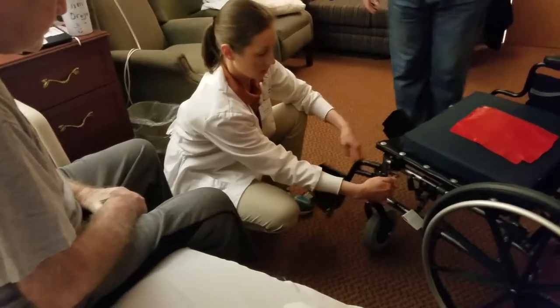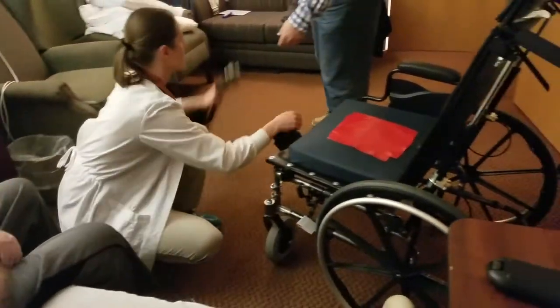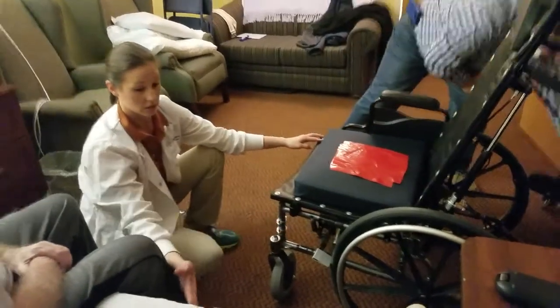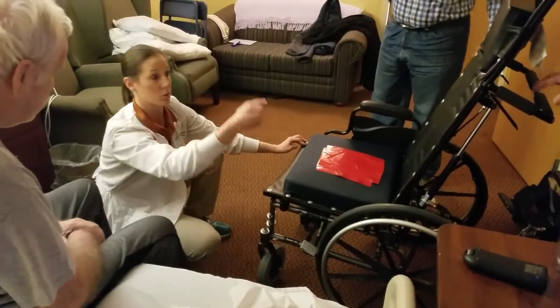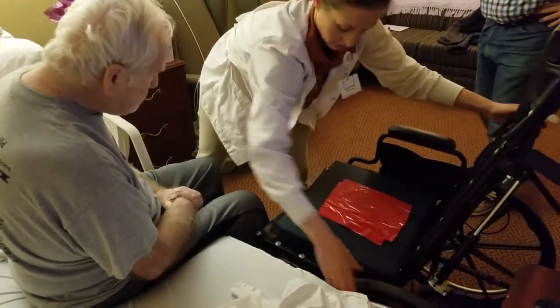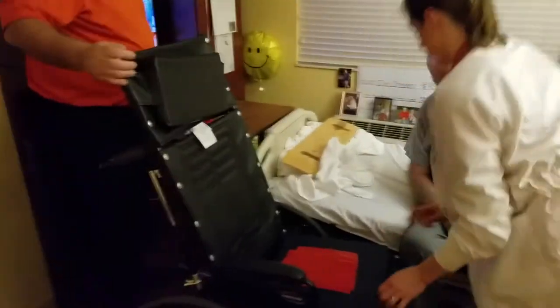There's a button here — if you just push it in, that swings the footrests out and then you can pick them straight up. Same thing on that side — swing both of them away. You need to take the left one off; that right one can stay or you can take it off. The armrest closest to the bed definitely needs to come off — it's just that button that pulls up. Get the wheelchair as close to the bed as you can, both the front and the back, then push the brakes down.